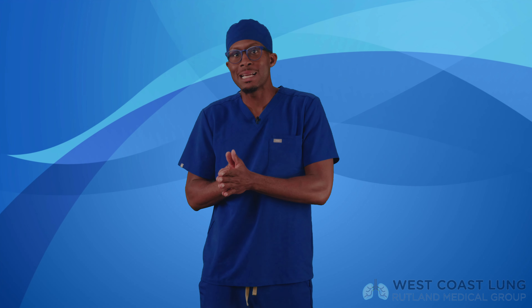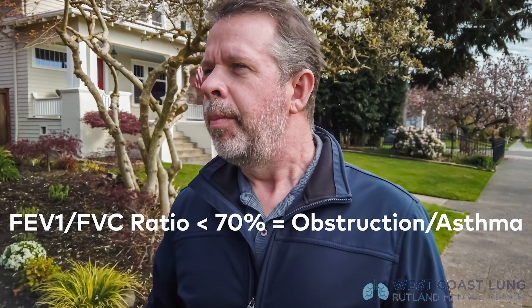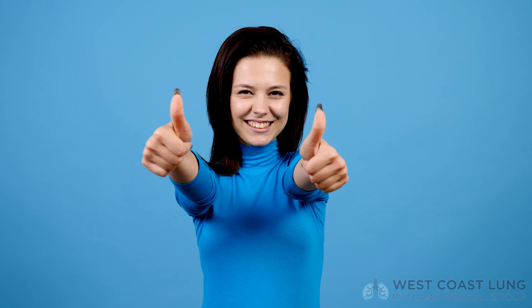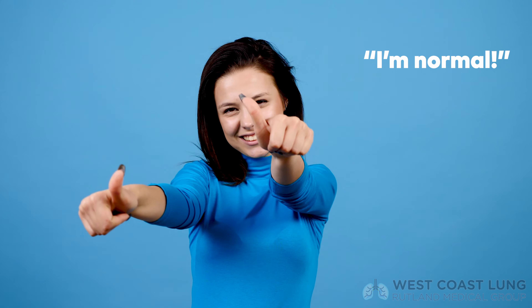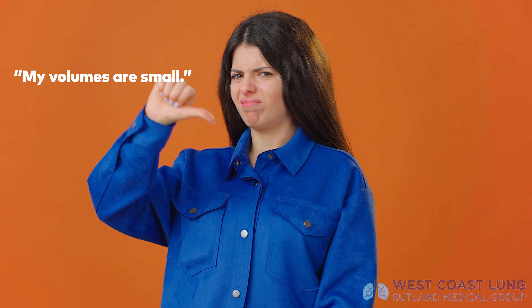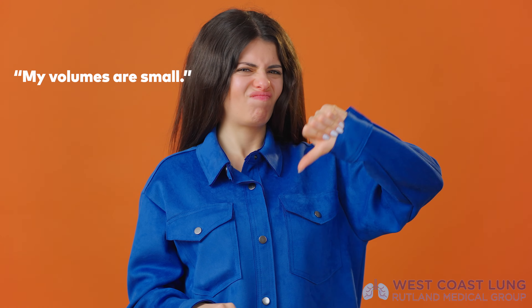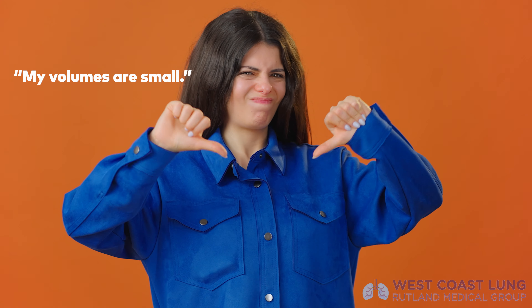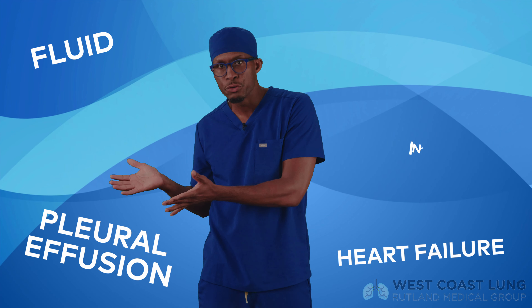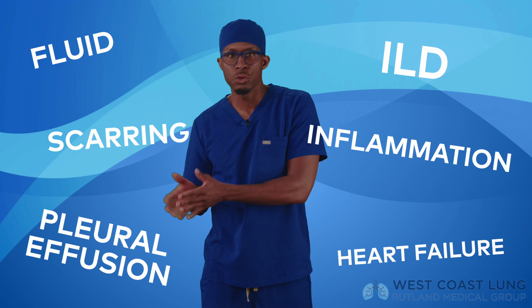If your ratio is less than about 70%, we say you have obstruction, which represents asthma and/or COPD. If your ratio is normal but you have smaller than predicted lung volumes, it means you're breathing with a smaller lung. This could be due to fluid, like in heart failure or a large pleural effusion, or due to inflammation or scarring, like in interstitial lung disease.